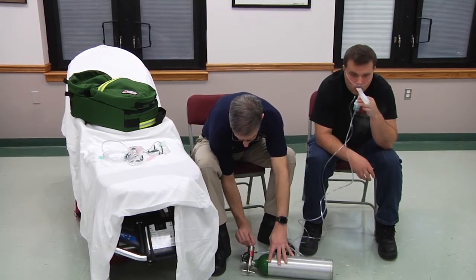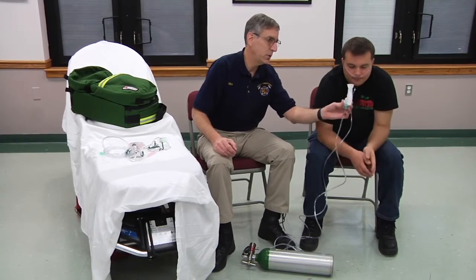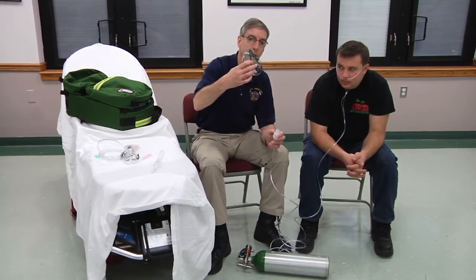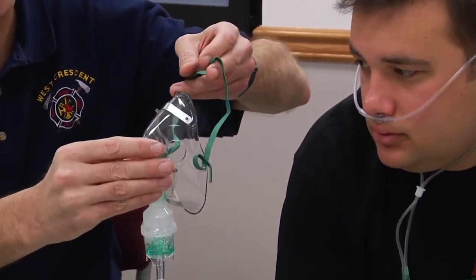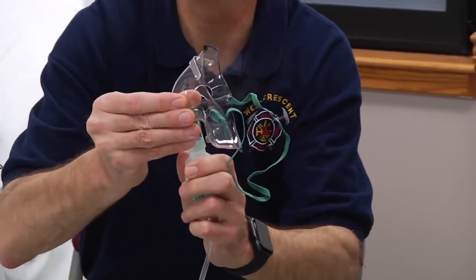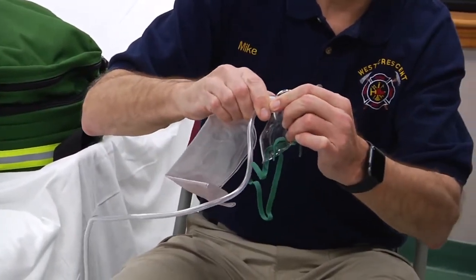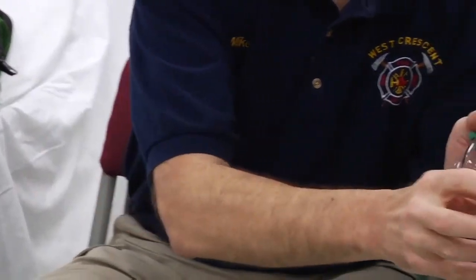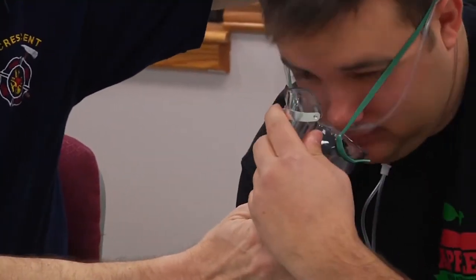Not all patients can actually tolerate holding a nebulizer. If that's the case, you may choose to take an aerosol mask, put the mask on the patient with the nebulizer attached to it, and the mask would fit right onto the patient's face. If you don't have an aerosol mask, you probably have a non-rebreather mask. If you take the non-rebreather and pull the non-rebreather piece out of the mask, you have a fitting that the nebulizer will fit right into, and the mask can be put on the patient's face so that the nebulizer can be administered without the patient holding it.